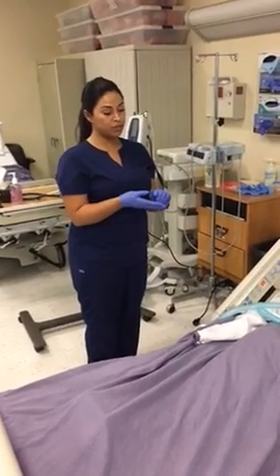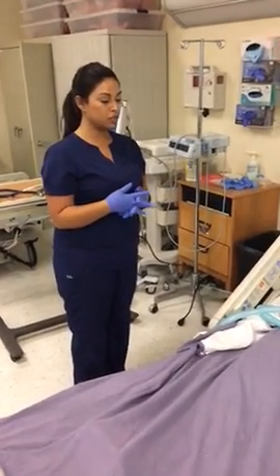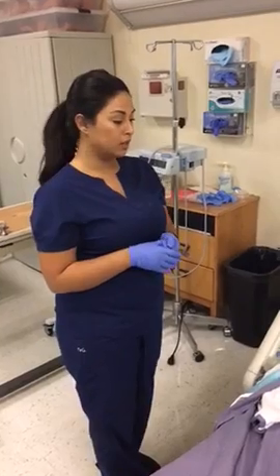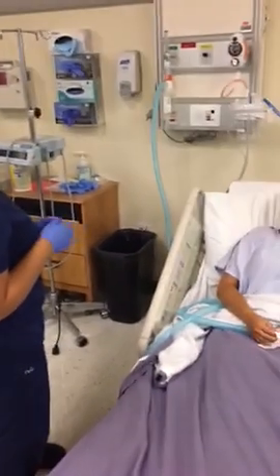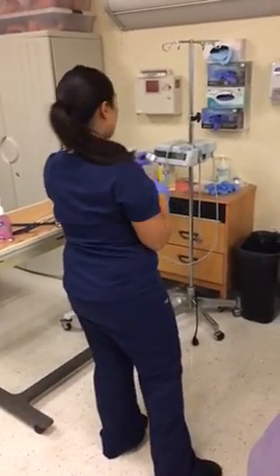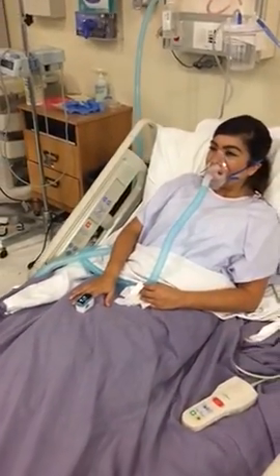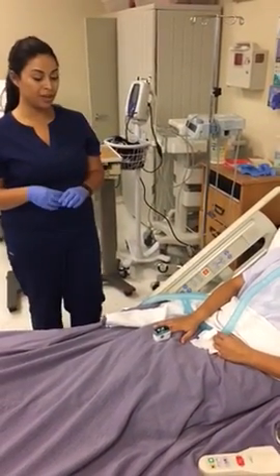I really want to pay attention to the type of secretions that come out: the amount, the consistency, the odor. It can help me to further assess what the patient needs. Okay, after about 15 minutes, I'm going to go ahead and take your vitals now. I'm going to put this back on your finger. Do you feel a little better now with that? Okay, that's very good.